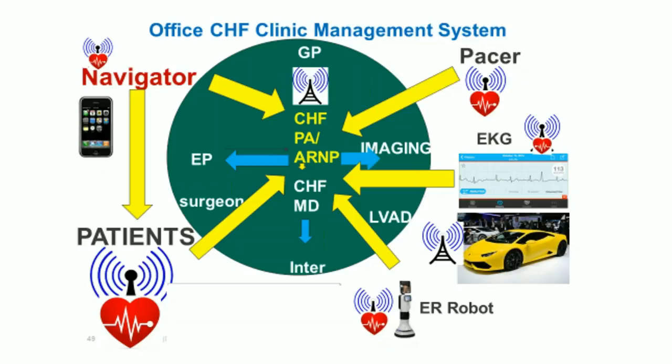There's a system called Vidyo, V-I-D-Y-O, that offers that, going from the phone to massive amounts of telemetry data every day to a tech or a nurse who might be sitting in front of 7 monitors, monitoring 7 patients 1,000 miles away, looking at their images, their catheter information, EKGs, respiratory, and a database of vital signs, and talking to them and looking at their picture.